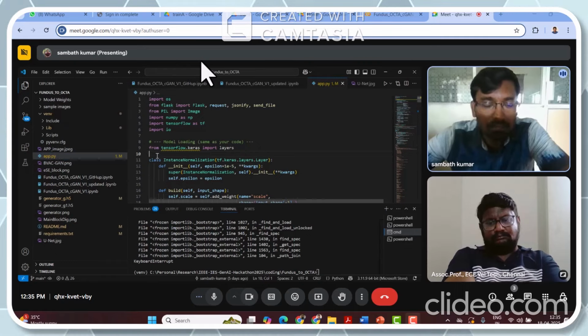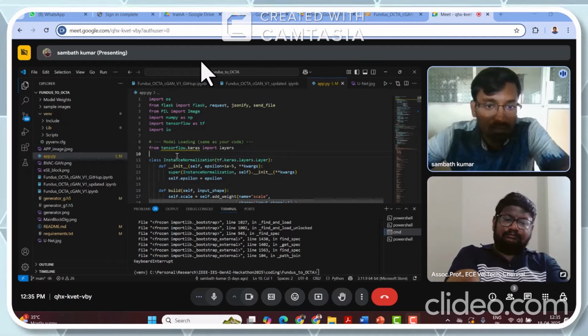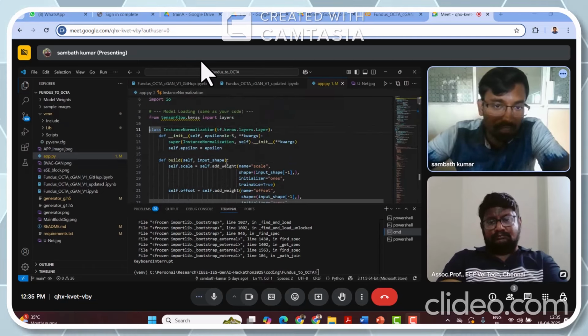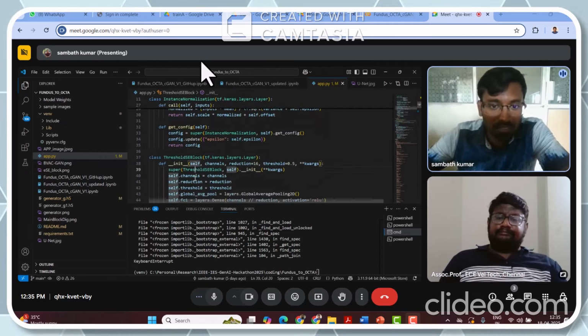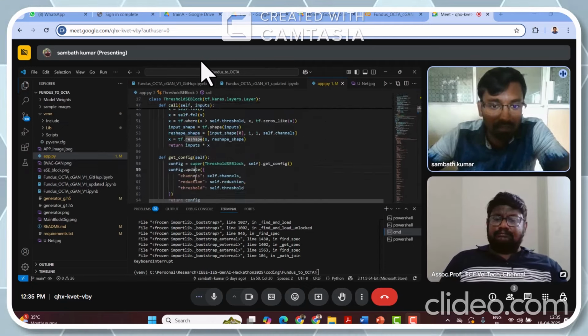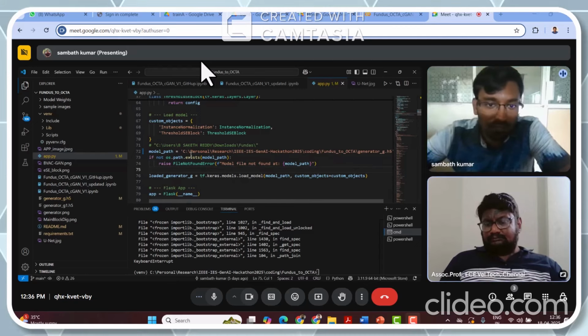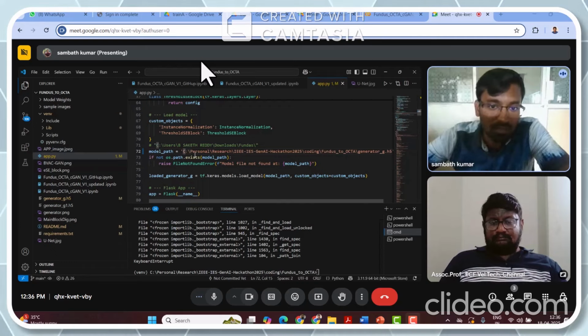With the help of CGAN, here we have developed a front end, and the same thing we are going to give to the doctor on a local machine. This is developed with the Flask framework. These are the same necessary blocks we have developed: instance normalization as well as the customized SE block. After that, we have called the U-Net also. After training, we have saved our model, and the same model we have called here.